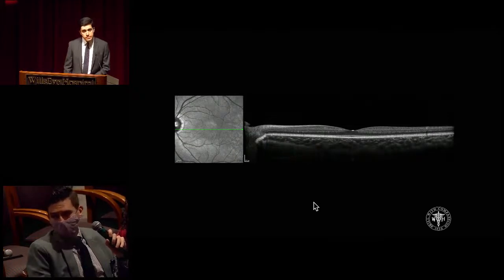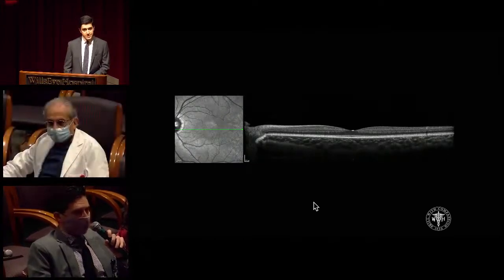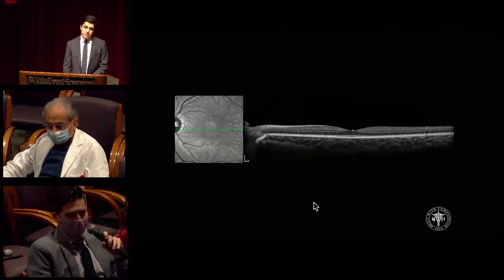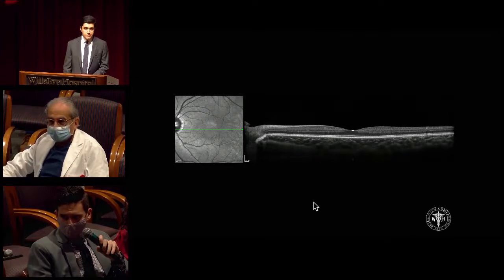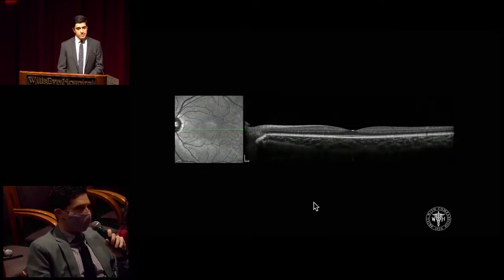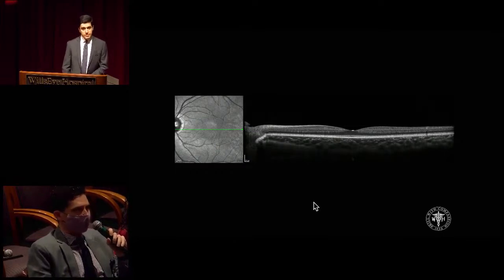Sickle cell, what would you call those black lesions in the periphery? Well, I know the hyperpigmented lesions in non-proliferative sickle cell retinopathy are usually referred to as sunburst lesions. Other things on the differential, still less likely, would be FEVR, which can have peripheral vascular attenuation, ROP, any history of that in infancy. You could also consider other inflammatory conditions like sarcoid, but I think those are probably all less likely.